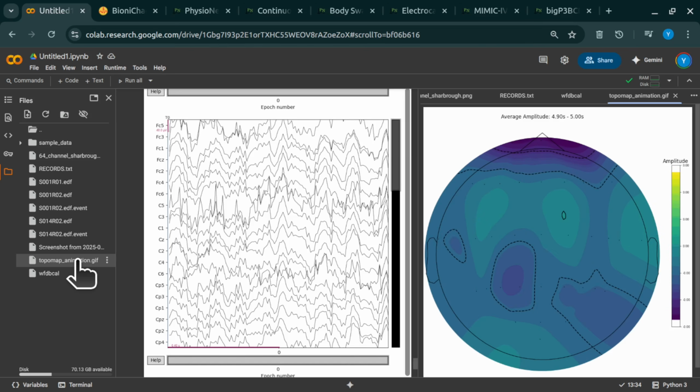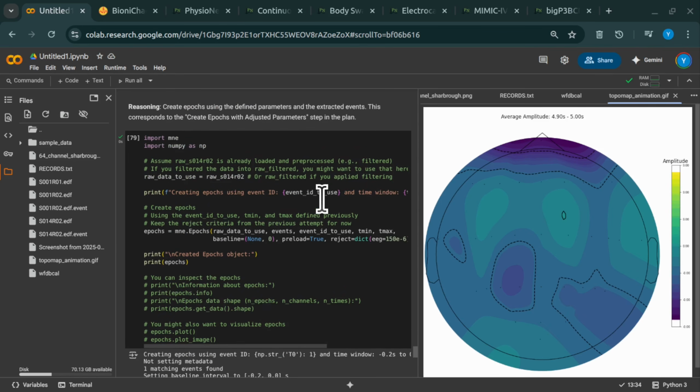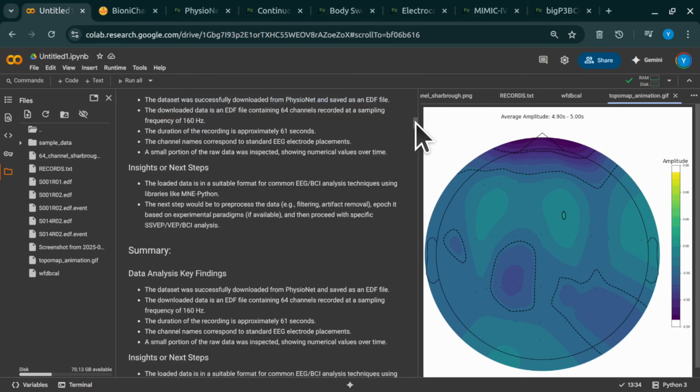It might seem that way, but it's surprisingly within reach. It's just a really intricate process, starting with very sensitive measurements. It really is, and that's exactly what we're going to dive into today. Welcome, everyone, to our deep dive into the fascinating world of EEG, electroencephalography. Our mission for you today is basically to unpack a whole stack of technical sources that detail this journey: acquiring, processing, and then visualizing real EEG data.